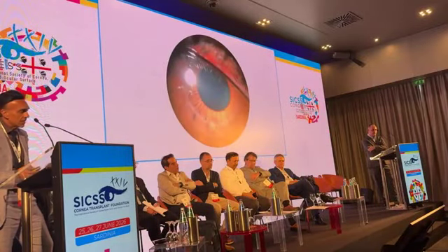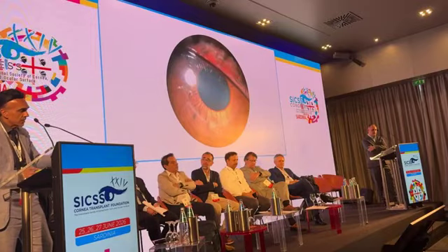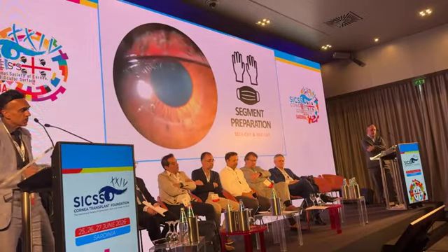Okay, this is what the segment looks like if you don't do the surgery yourself. At the bottom, you can see that segment, a line there of tissue similar to what we saw in the live surgery.